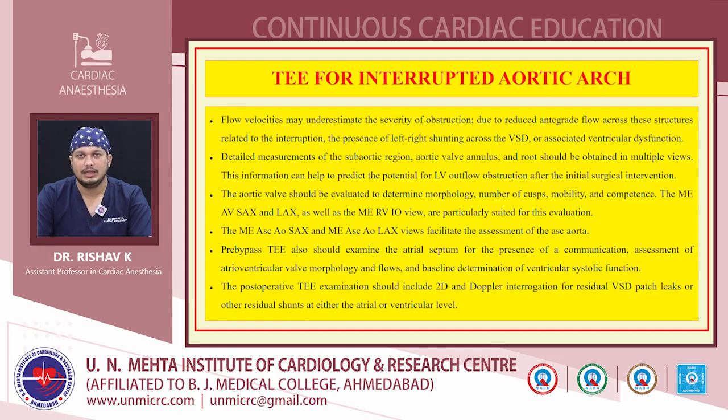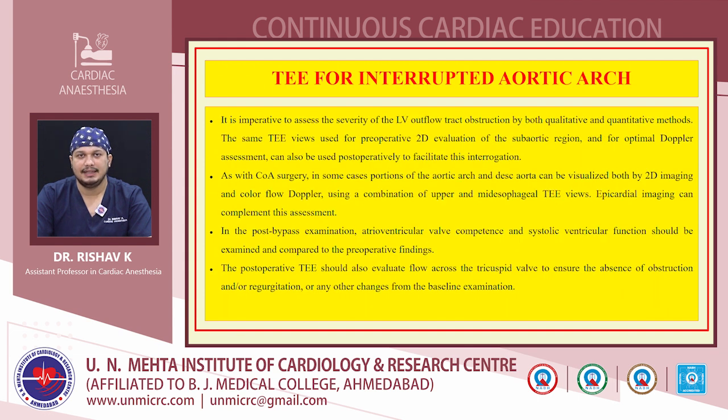Post-operative examination should include 2D and Doppler interrogation for residual VSD patch leaks or other residual shunts at either the atrial or the ventricular level. Also, it is imperative to assess the severity of LVOT obstruction by both qualitative and quantitative methods. So here TEE can be very useful. The same TEE views used for pre-operative 2D evaluation and for optimal Doppler assessment can be used post-operatively to facilitate this interrogation.